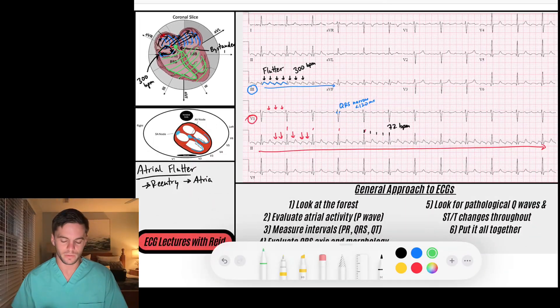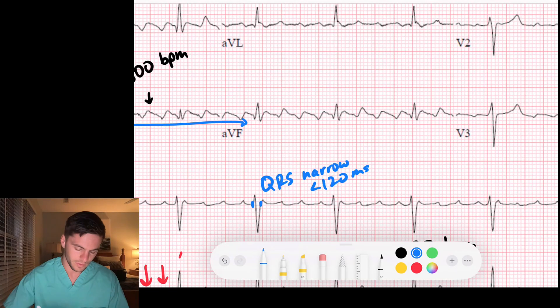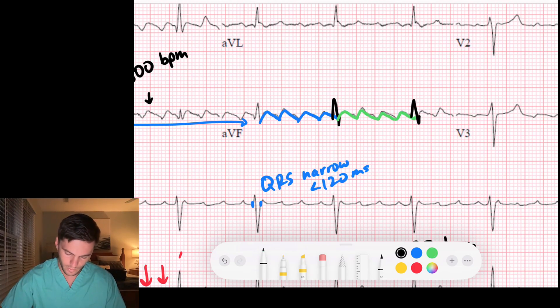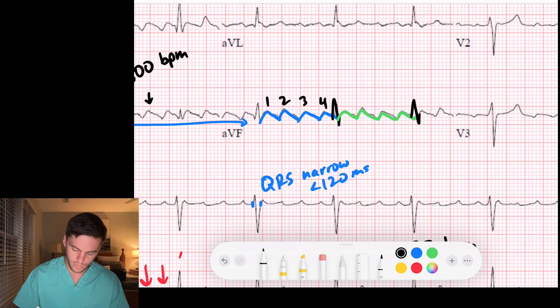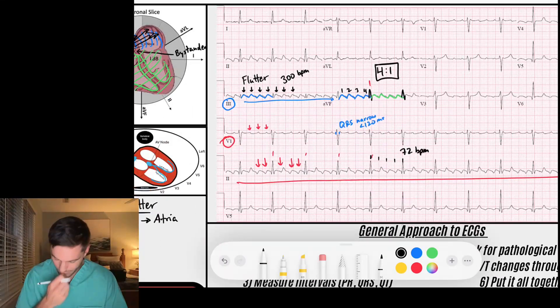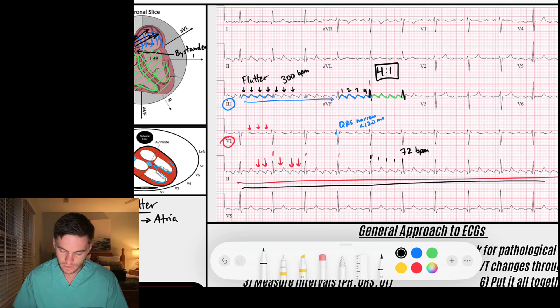Now let's determine how many flutter waves occur per QRS complex. Looking at the AVF lead, I count one flutter wave, two, three, four — and then after the fourth, I get a QRS complex. Then again: one, two, three, four flutter waves, followed by a QRS complex. So what I'm seeing is four flutter waves for every one QRS — that's 4:1 conduction. We confirm this 4:1 conduction is consistent throughout the rest of the strip.